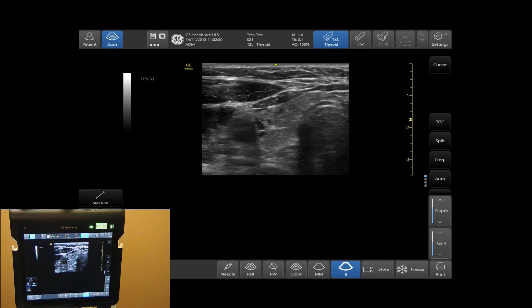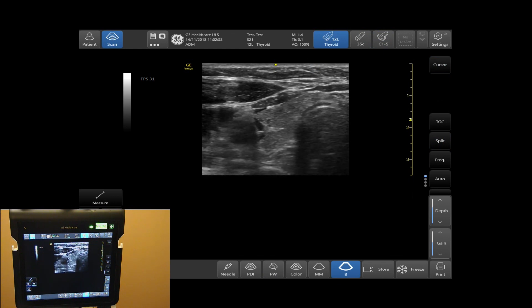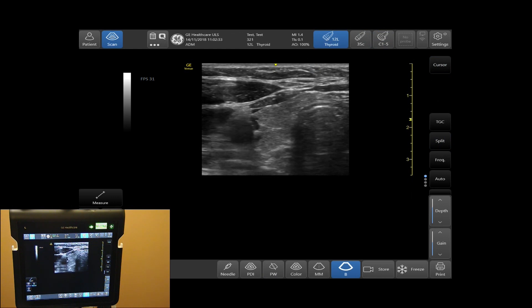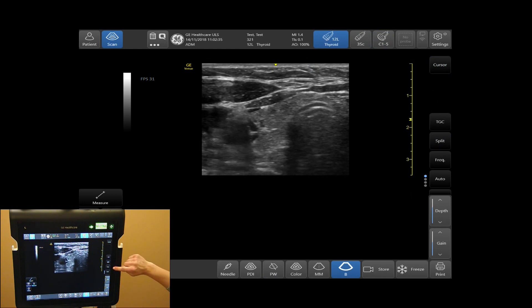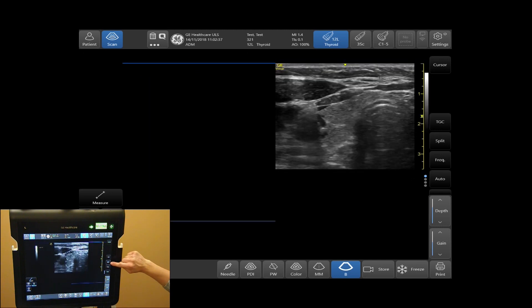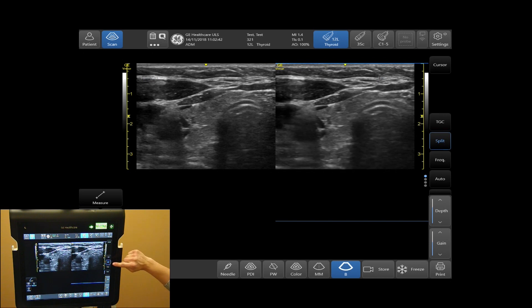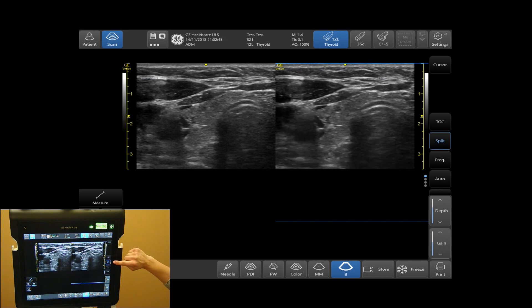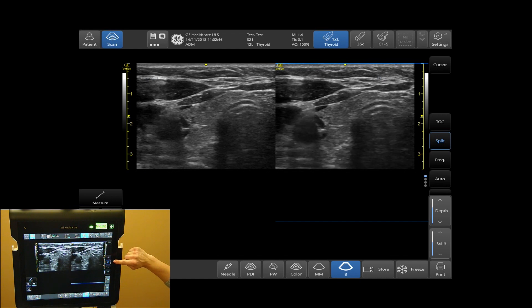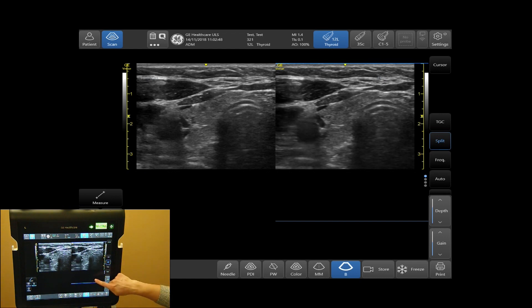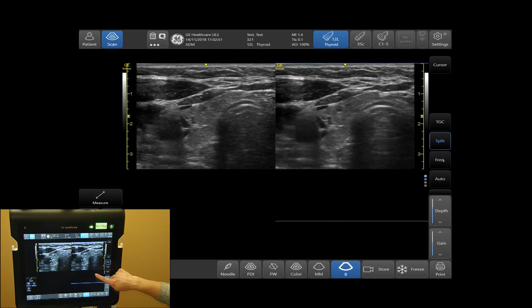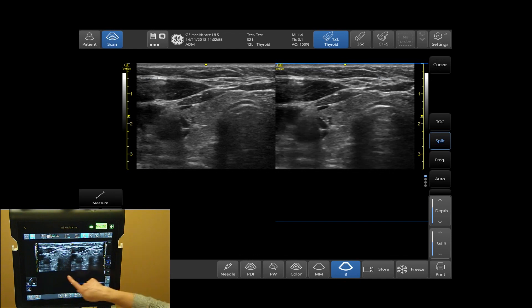To activate your split or dual screen, tap your split tab on the right-hand side of your menu. Here you will have two images displayed on your screen. The side where the blue bar is displayed will be your active side. To activate your left-hand side, simply tap on your left-hand side.